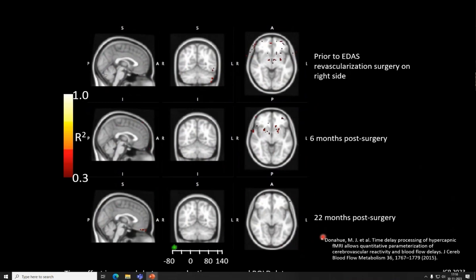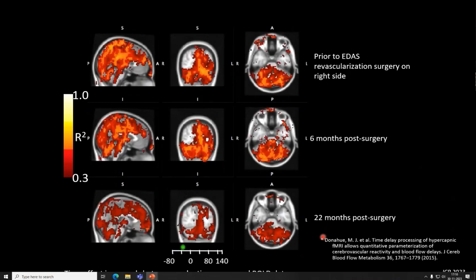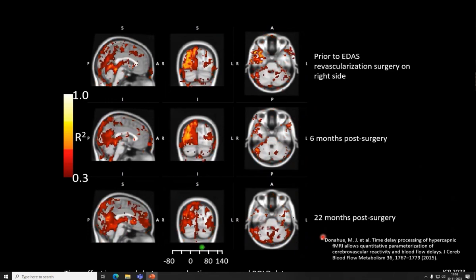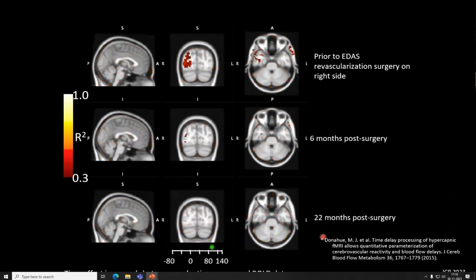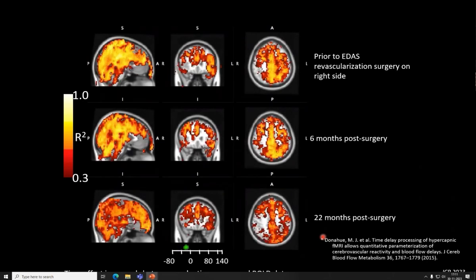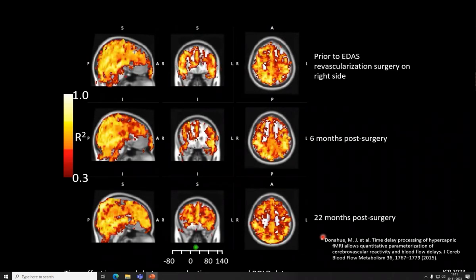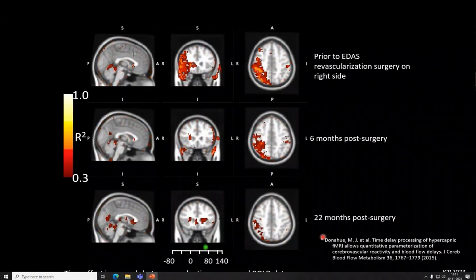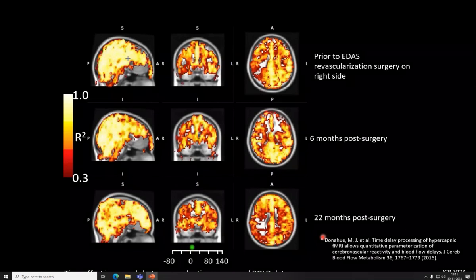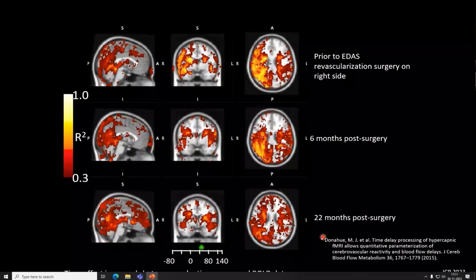I was very happy at one ISMRM. I actually saw somebody who was doing CT angiography where they used logarithmically spaced time points. The problem is if you go out to 140 seconds at the time resolution you usually use for CT, you cook your subject, and that's not good. So she had the brilliant idea that, I'll take 0 time, 0.1 seconds, 0.2, 0.4, 0.8, and just keep going, take the same number of steps, but over a longer period.